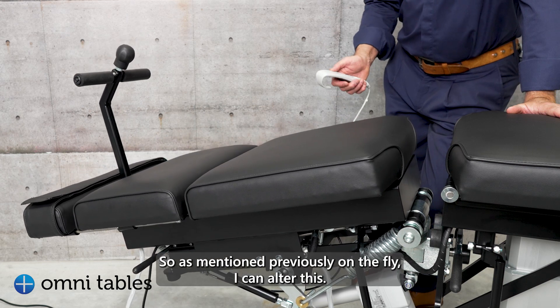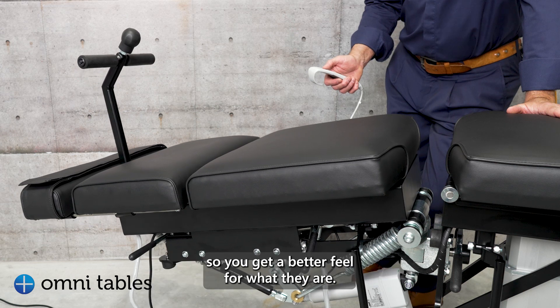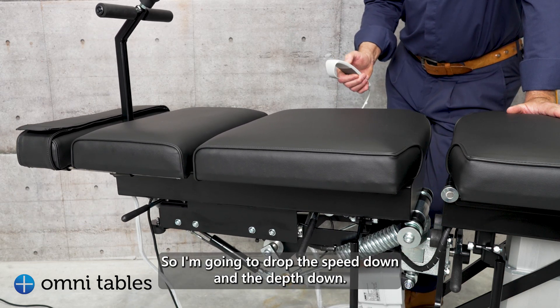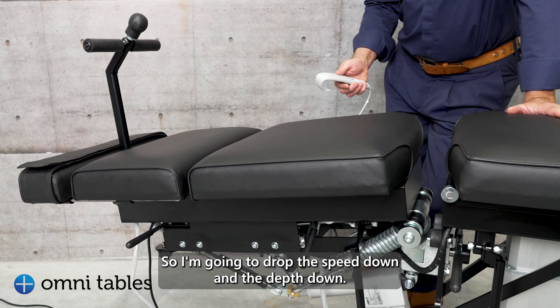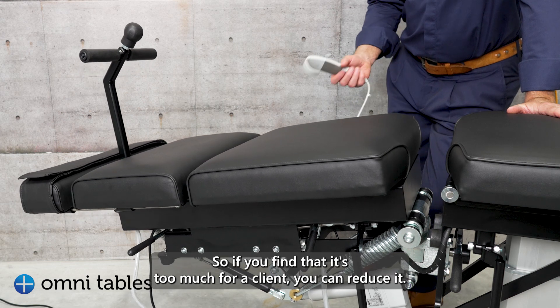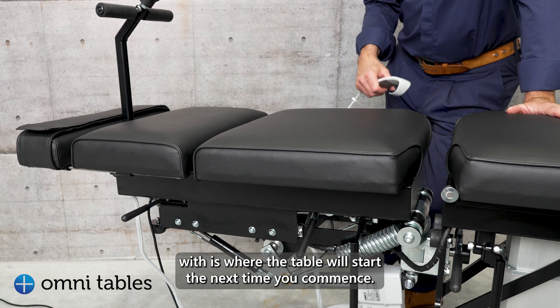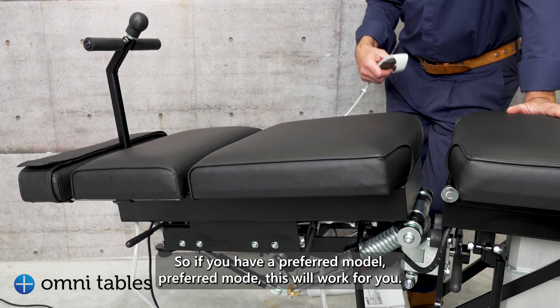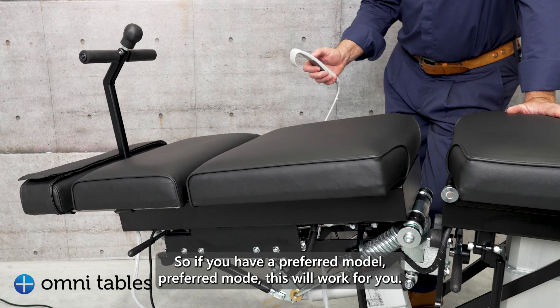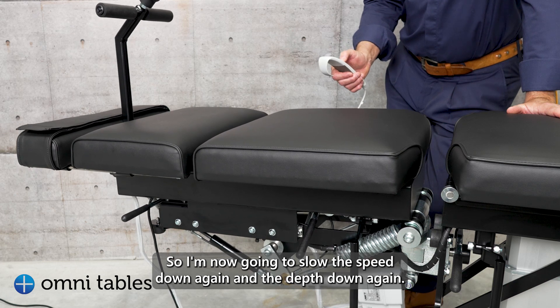On the fly I can alter the settings — I'm going to go through each of the speeds and each of the depths so you get a better feel. I'm going to drop the speed down and the depth down. If you find it's too much for a client, you can reduce it, and whatever setting you finish with is where the table will start next time. I'm now going to slow the speed down again and the depth down again.